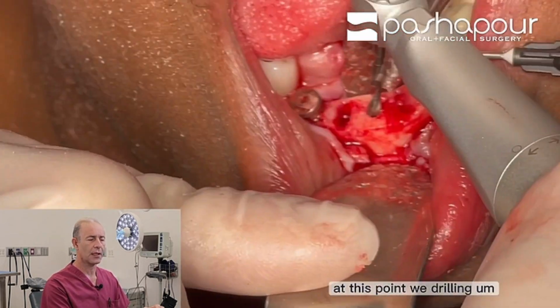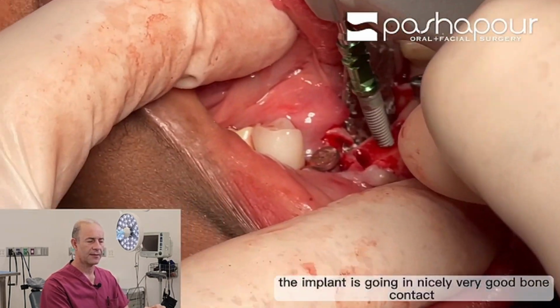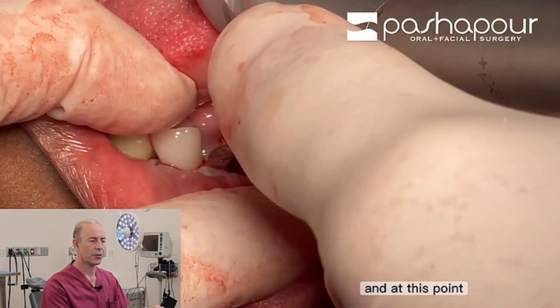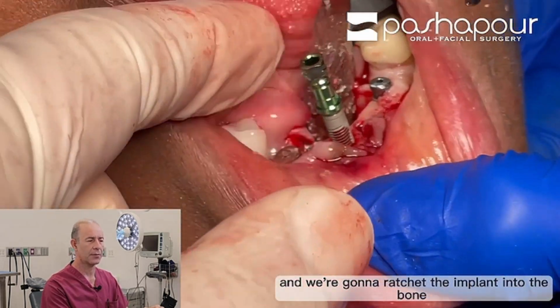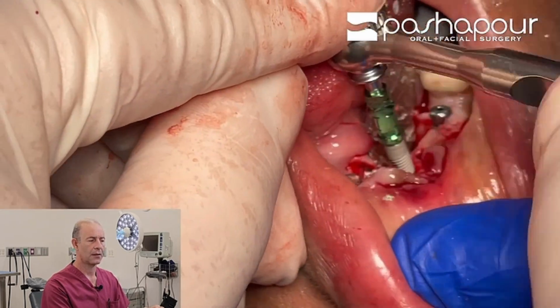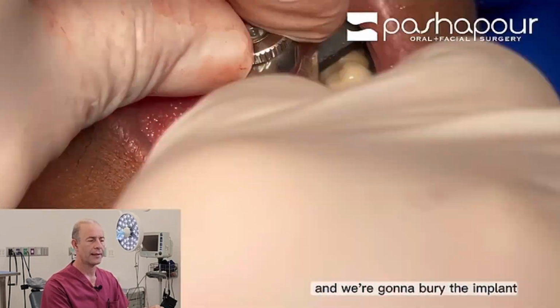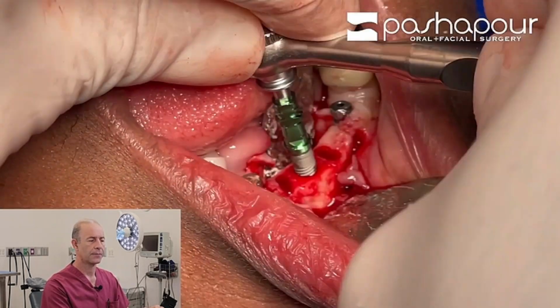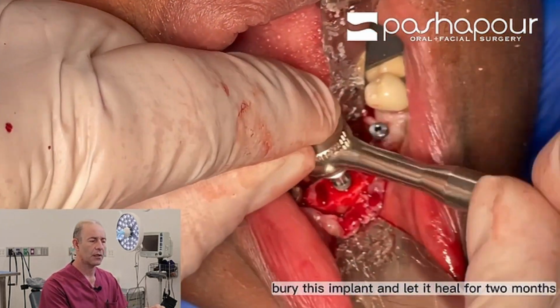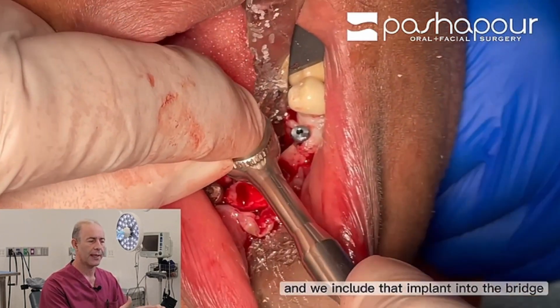At this point, we're drilling for placement of a middle implant. The implant is going in nicely. Very good bone contact, and at this point we're going to take the drill out and we're going to ratchet the implant into the bone. The torque, again, is a very good torque, and we're going to bury the implant. The idea here is to bury this implant, let it heal for 2 months to make sure the implant is nicely integrated, and then we come back and we include that implant in the bridge.